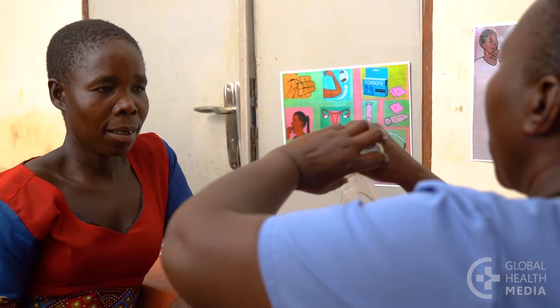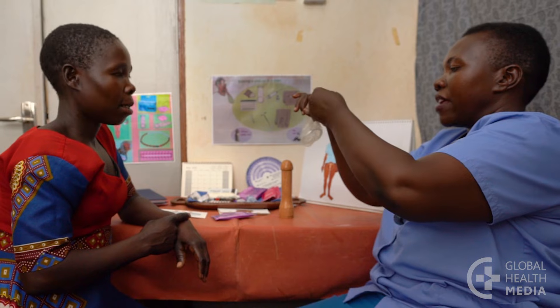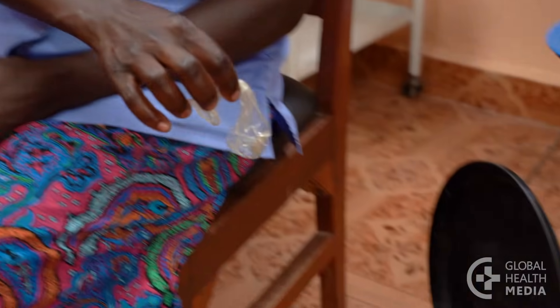When she's ready to remove the condom, she squeezes the outer ring and twists it to keep the man's sexual fluid inside the condom. Then she pulls it out and throws it away in the trash or latrine.